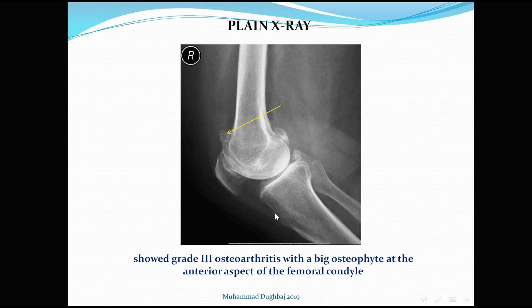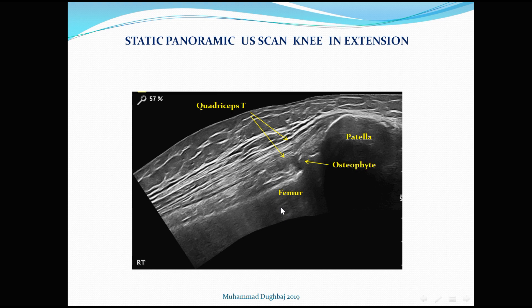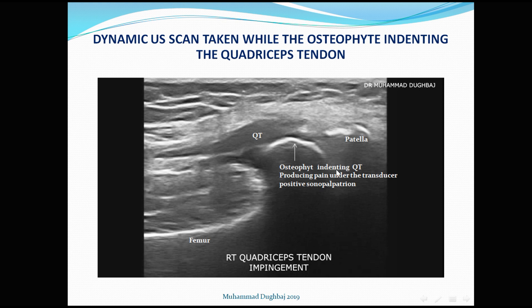In the lateral view we can see a supratrochlear osteophyte with a horizontal direction, with the soft tissue of the quadriceps tendon nearby. We expect that during flexion this osteophyte causes compression over the quadriceps tendon, producing true quadriceps tendon impingement. On static panoramic ultrasound view in extension, we can identify the patella, quadriceps tendon, femur, and the supratrochlear osteophyte. In flexion, the quadriceps tendon appears edematous and swollen compared to its distal and proximal parts, and the osteophyte can be seen compressing the tendon.